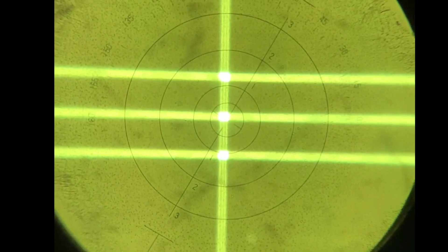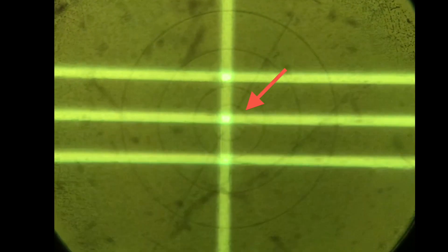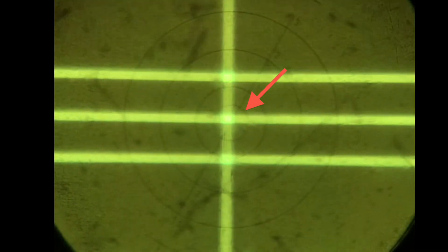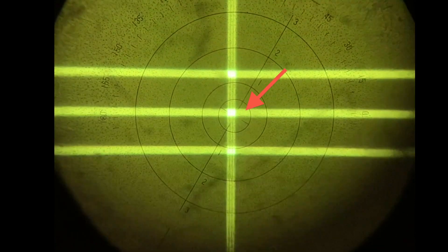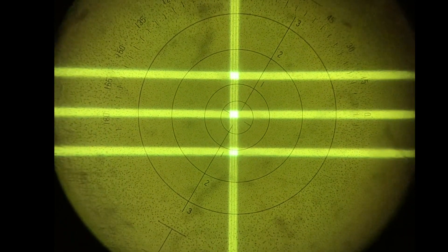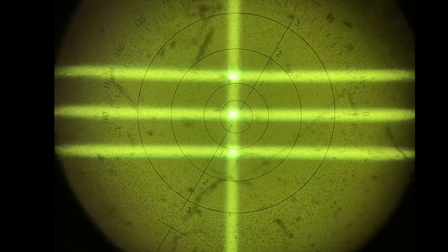The first step in manual lensometry is focusing our reticle. The best way to focus the reticle is to turn it all the way plus, and then slowly turn it back towards plano or minus until it comes into crisp focus. By focusing our reticle first, we ensure that we are reading the prescription correctly.